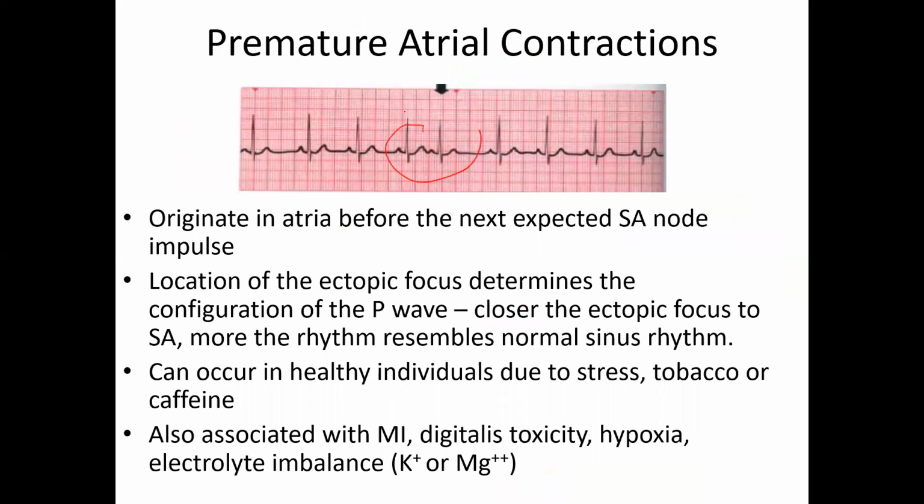So here's the premature atrial contraction. I know we'll never call it sinus, so always just say atrial and you'll be correct. You'll be cool.